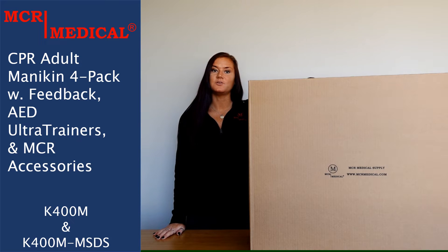This kit includes four Preston adult mannequins with feedback in a nylon carry bag and 50 adult lung bags, four Preston AED ultra trainers in a nylon carry case, four mani vests, and four CPR kneeling mats. This particular kit is sold in medium skin tone and diversity packs.